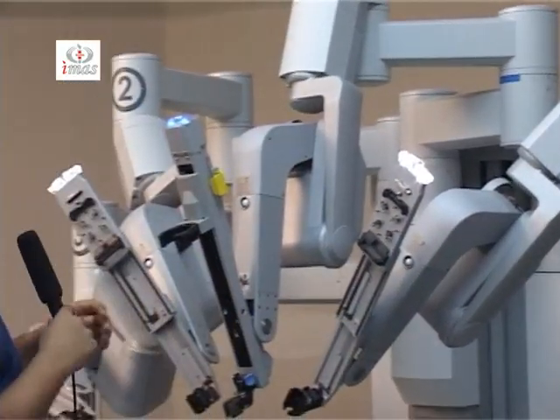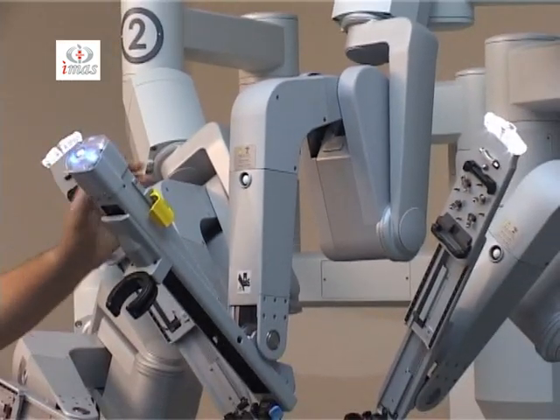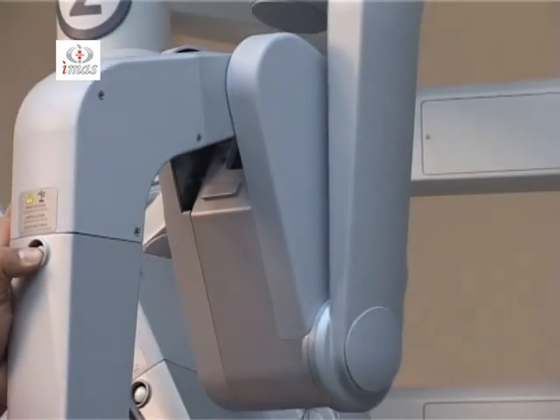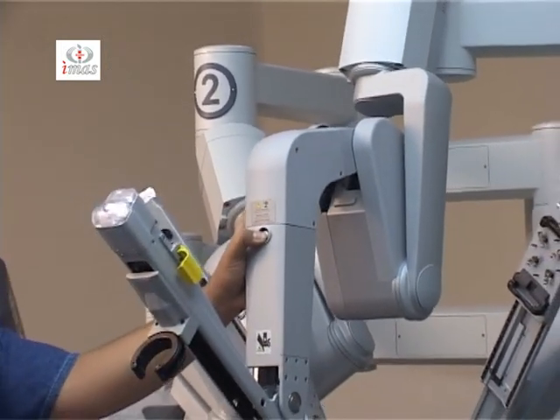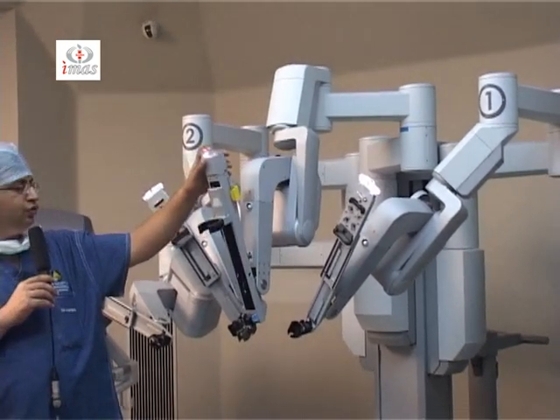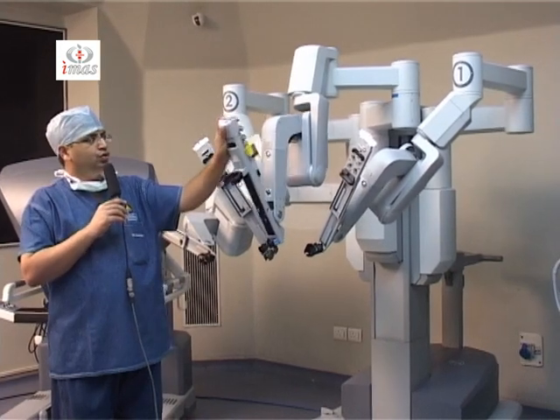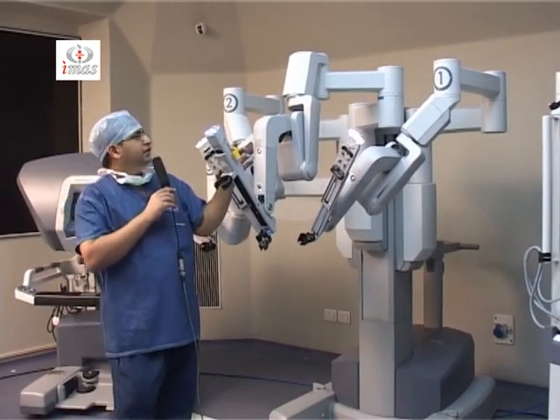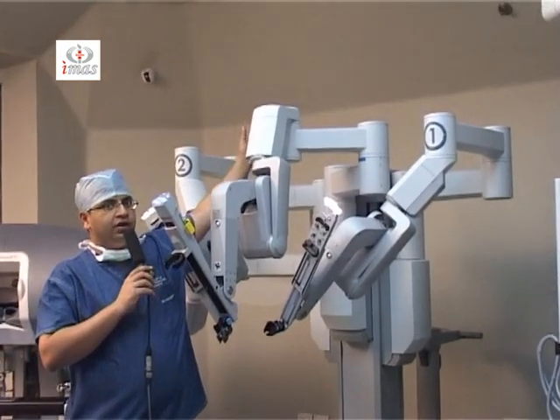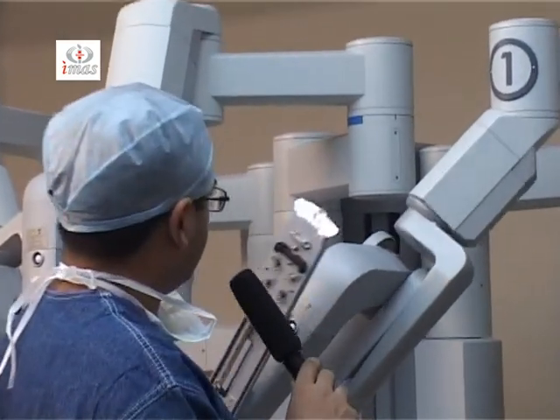And these arms can be moved using these buttons. This is the port clutch button, which is used to move the arm grossly, and this is the clutch button, which is used to move the distal aspect of the arm in whatsoever direction you want to. If I explain this, you can see here.